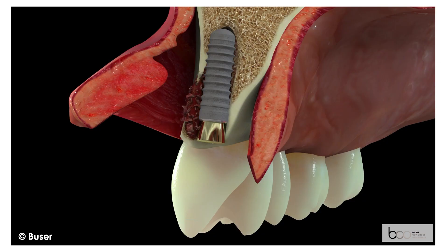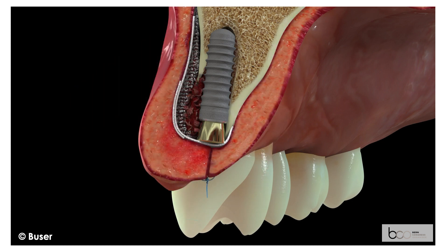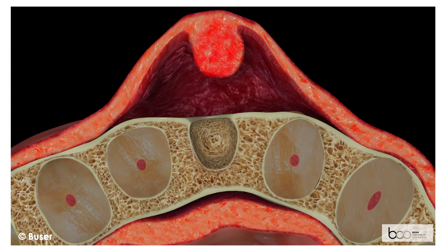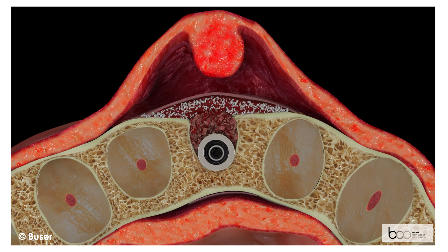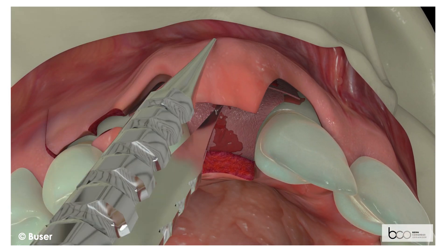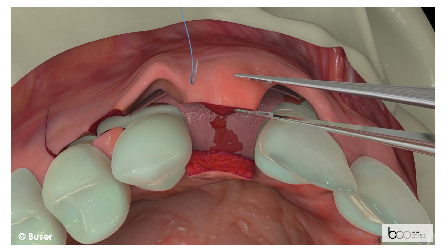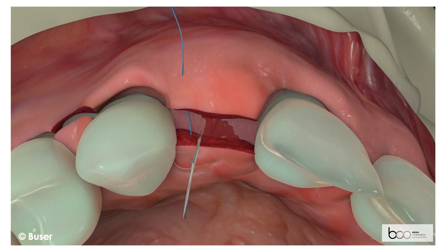The sagittal and coronal views show the various steps of contour augmentation. The bone chips fill the bone defect and stimulate new bone formation, while the bovine bone particles provide contour augmentation and long-term stability due to their low substitution rate. The collagen membrane provides a barrier function to avoid the ingrowth of soft tissue cells. The surgery is completed with a tension-free primary wound closure using interrupted single sutures with 5.0 non-resorbable monofilament suture material.